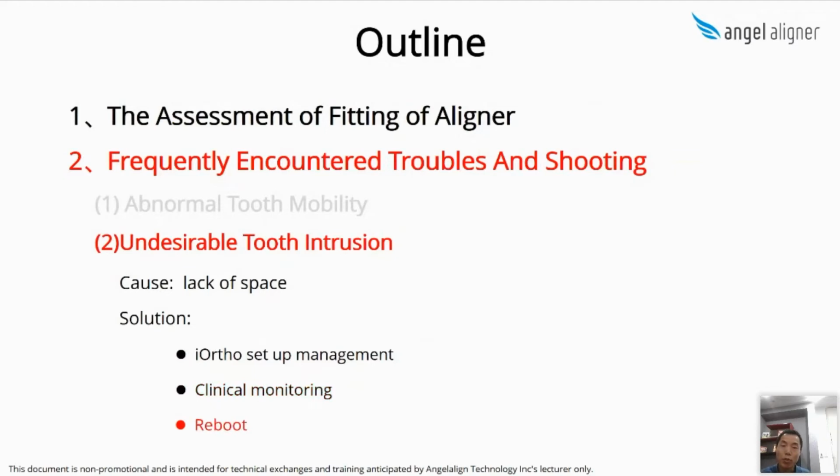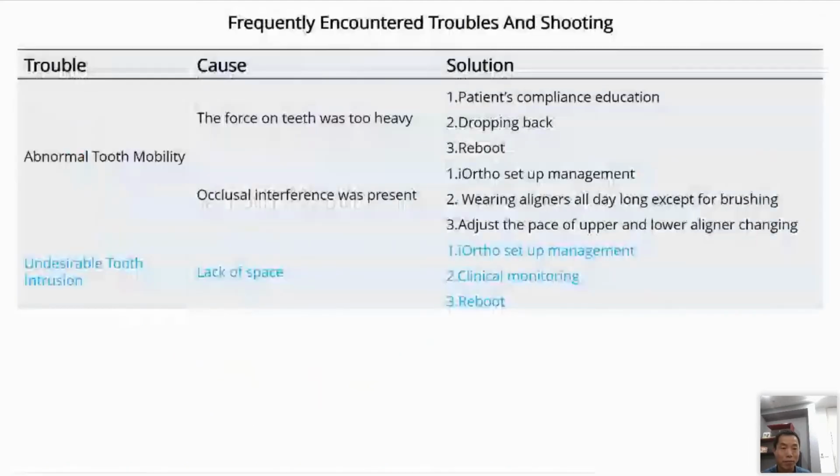If the patient comes to you with a severe tooth intrusion, rebooting and starting a mid-course correction is necessary. So sometimes we have to reboot in some cases. So this is also a summary in table form for the undesired tooth intrusion, the cause, and the solution.